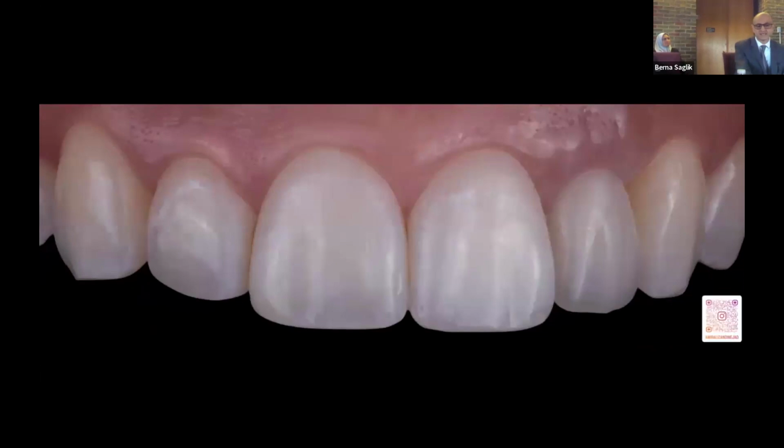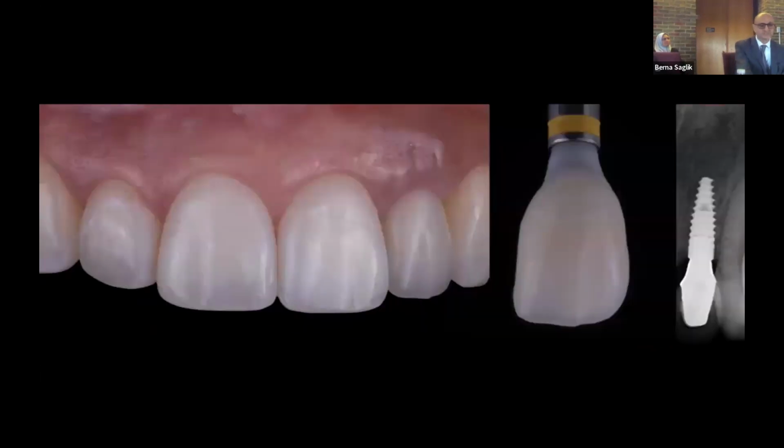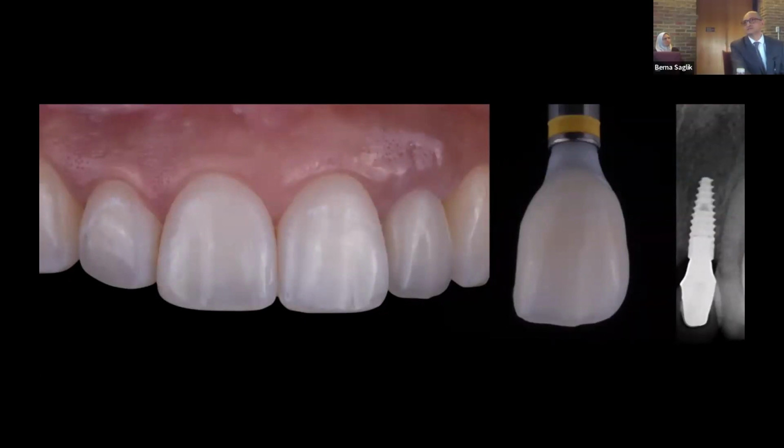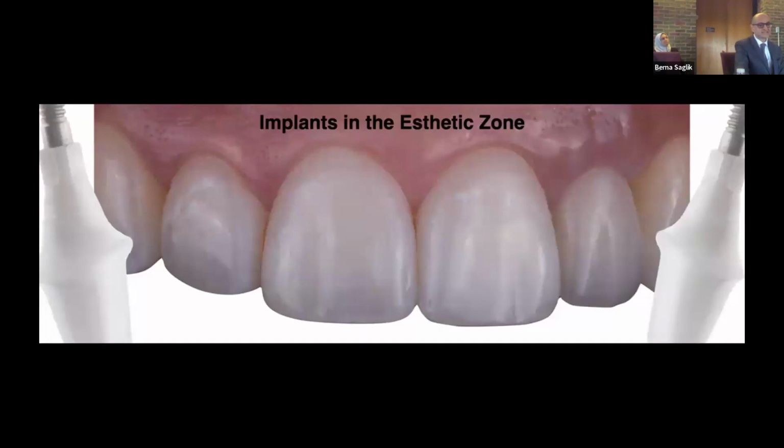Number 10 is basically an implant crown, but I used a zirconia abutment because the soft tissue thickness was not there. Although I think the phenotype is not very thin, maybe medium, not thick either, I still couldn't hide the metal. The moment zirconia goes in, it's good. So we are taking some risk, but it depends on the patient. As long as I educate my patients about the risks and benefits, and they accept it, I feel very comfortable placing it. The key would be the zirconia abutment.